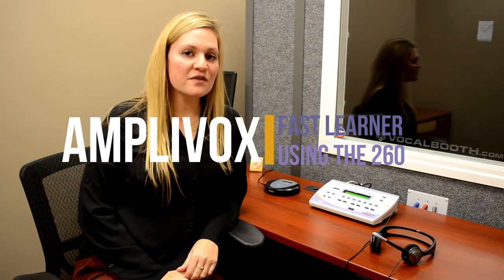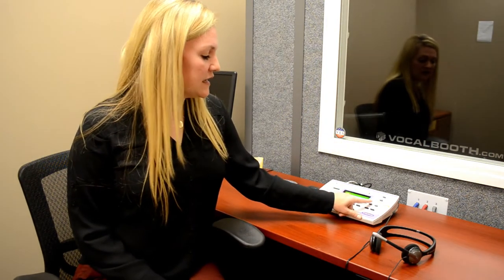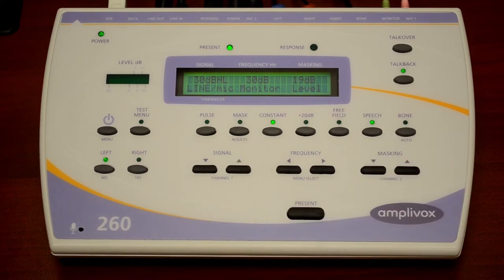So now we're going to go over the speech feature of the Amplivox 260. The first thing that you want to do is make sure that you have the speech button pressed. It should turn green.